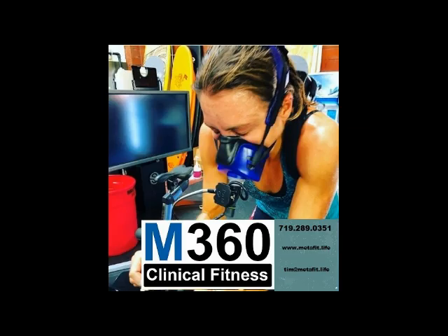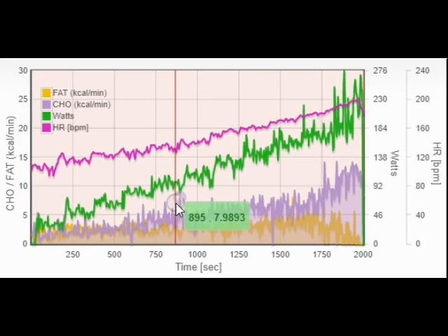Hello, please stay tuned for a less than optimal result here so you can see. All right, let's take a few minutes to look at the less than optimal CPET test here at M360 Clinical Fitness. Here, what's missing?